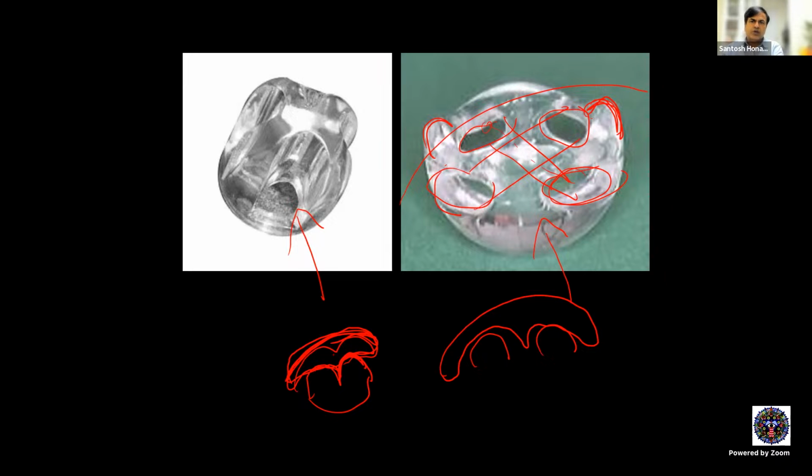There are also individuals who exteriorize the anterior portion of this implant and then put a prosthesis on top of it. So there is some kind of a pseudo coupling there. So they are using even Castroviejo and Allen implants as integrable implants.